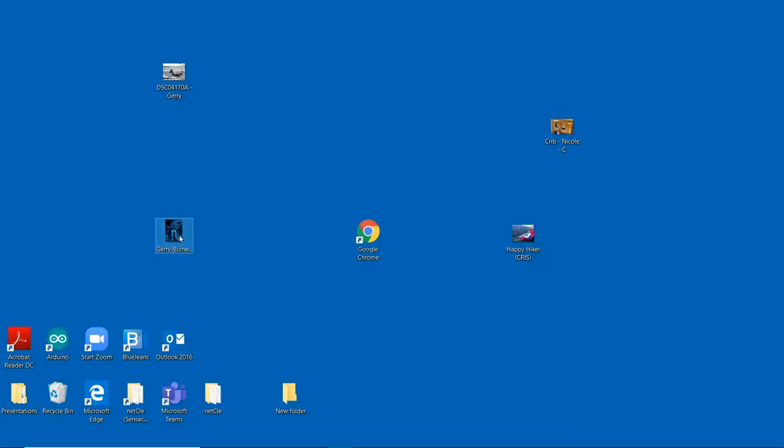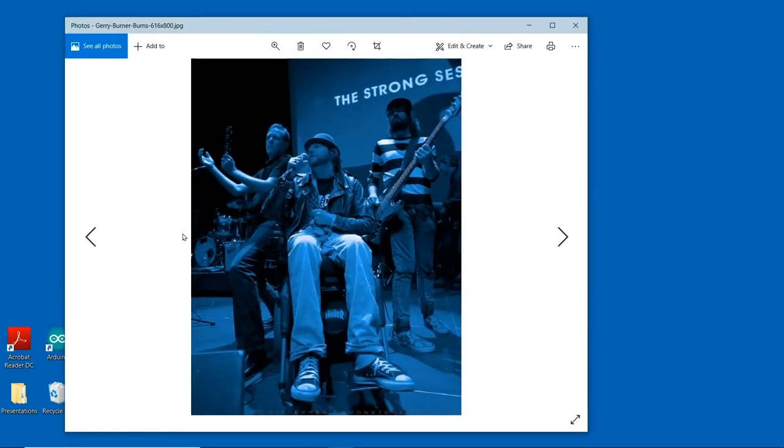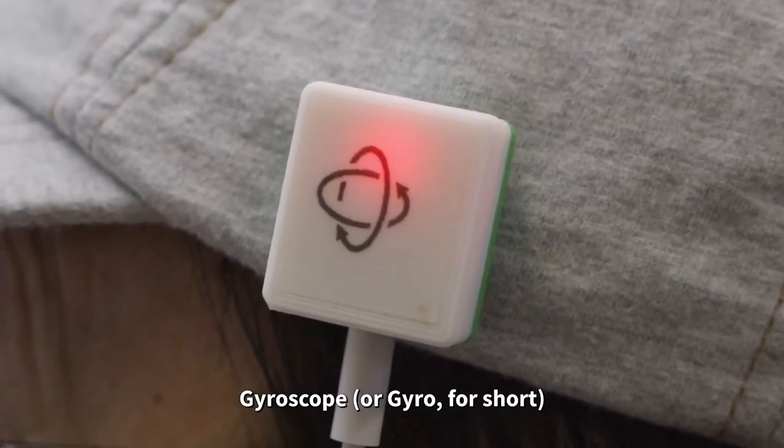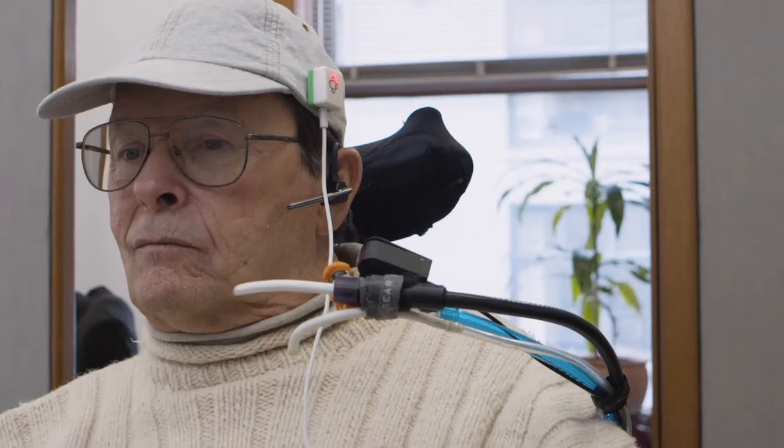You can activate a mouse click by touching the button briefly. Buttons and sensors can also be programmed to move the cursor. Finally, let's explore the gyro. When a gyro is attached to a headband or a hat, it allows a user to control a cursor by moving their head.